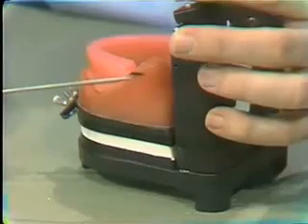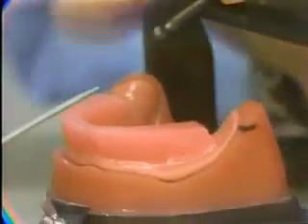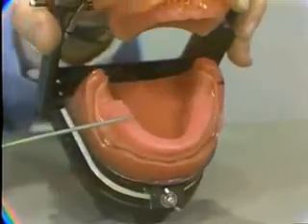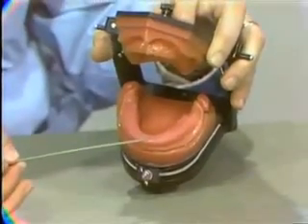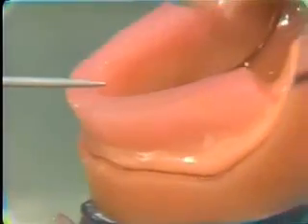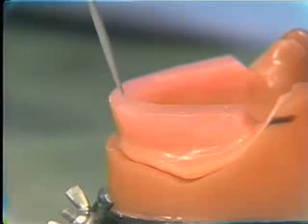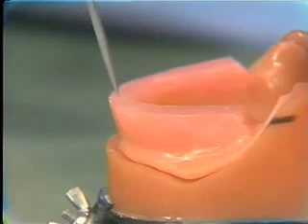Now, I've actually made a mark on the mannequin showing where I wanted the height of the rim. The other things to remember, and this will be checked by the instructors because it becomes important, even more than the impression stage, it becomes important now. We're a little wider in the posterior region, over the ridge. Don't get too far out to the buccal or to the lingual. As we come forward, it narrows to represent the incisor teeth. And routinely, as in most cases in the natural dentition, the anterior is labially oriented. The wax rim is not directly over the top of the ridge, but is labially oriented.